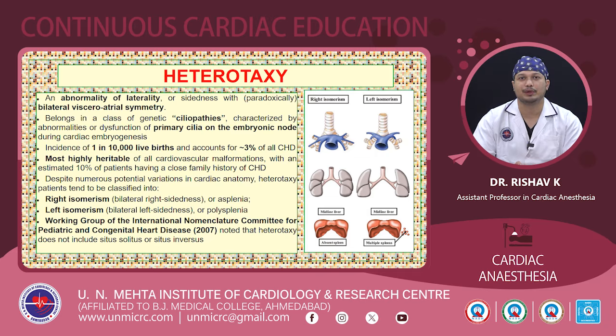In the interest of avoiding confusion, the working group of the International Nomenclature Committee for Pediatric and Congenital Heart Diseases have noted that heterotaxy does not include situs solitus or situs inversus. So here we will be dealing mostly with right isomerism, that is asplenia, and left isomerism, that is polysplenia, and we will be discussing the TEE evaluation of patients with such lesions.